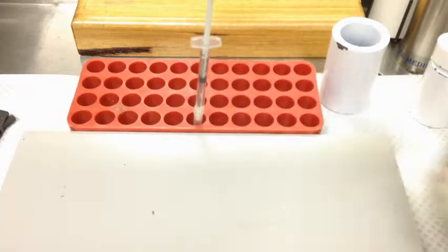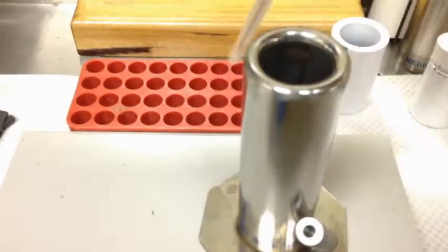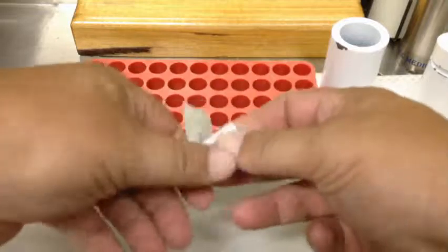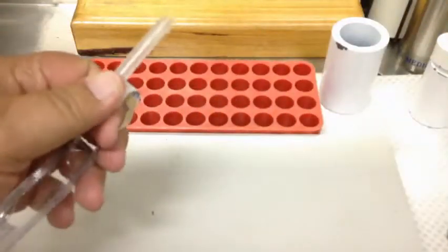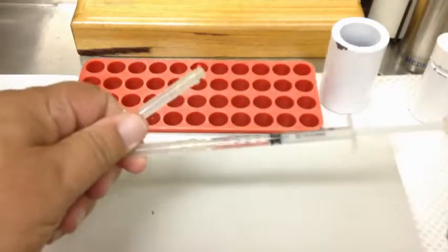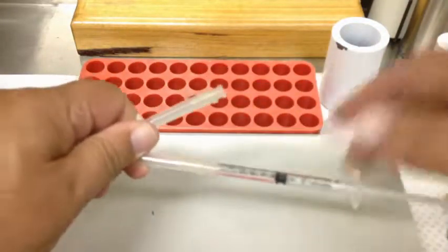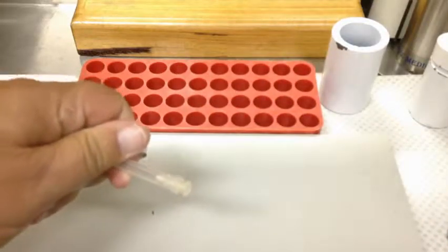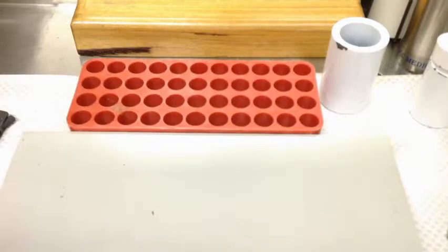Rather than leaving that syringe exposed, you'd put it in the lead pot sitting beside you if you need to make any adjustments — so it's not sitting out open. Now that I know I've got the activity I want, I'll change needles. We already saw how to change needles — I've opened the new one, I've got the old one. I just swap: the syringe with the new needle immediately goes back to the lead pot, and the old needle goes into the waste.